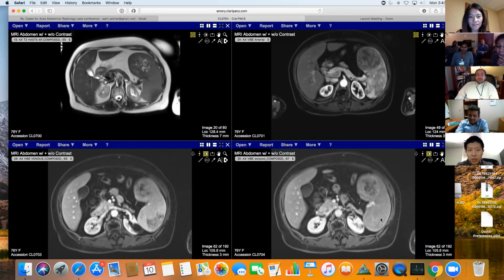Arthur mentioned SANT tumors. For the residents who are listening, SANT stands for sclerosing angiomatous nodular transformation of the spleen, in case anyone missed it. It's usually a solitary round mass that's T2 dark with progressive enhancement and spoke-wheel enhancement. So that big one kind of looked nice for it, but yeah, I don't know what's typical.